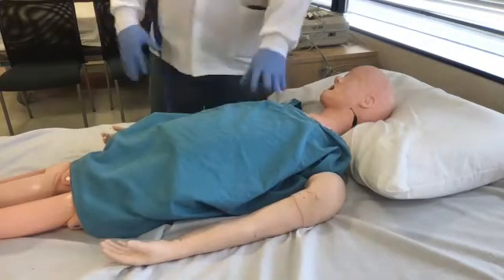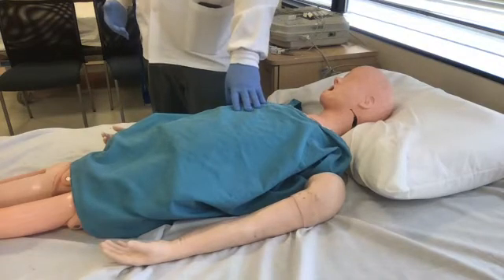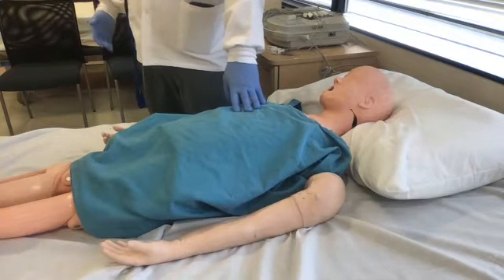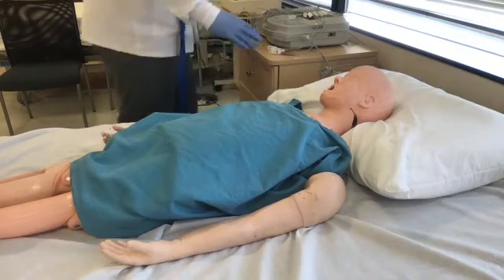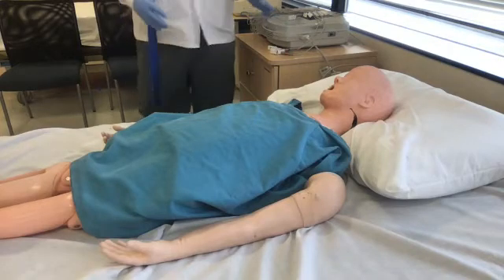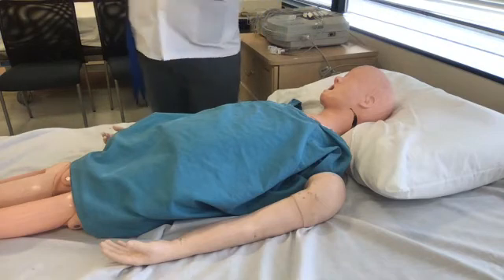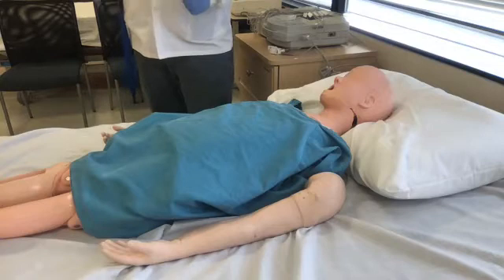So I have that. Now, what am I doing? I'm developing the rapport. Many times they're going to ask you, oh, I've seen this before, am I going to get shocked? Because they think it's a defibrillator. So I have a little placard here that says what an EKG is. You have your canned answer and say, hey, this electrocardiogram won't shock you.